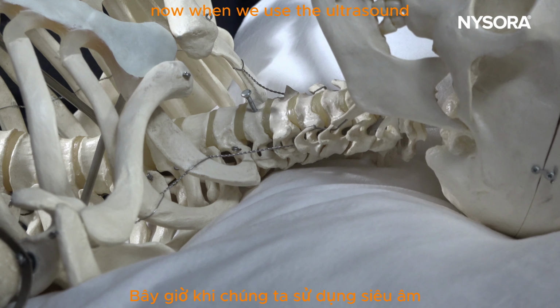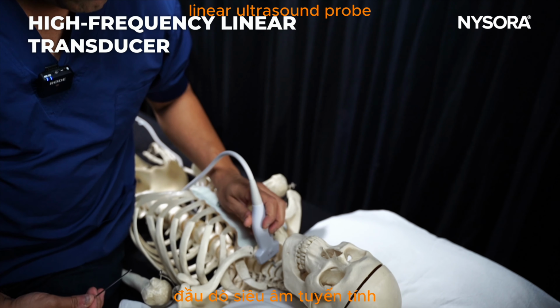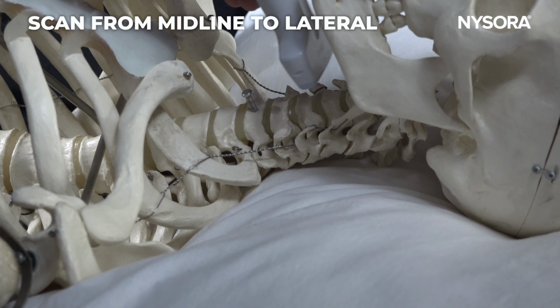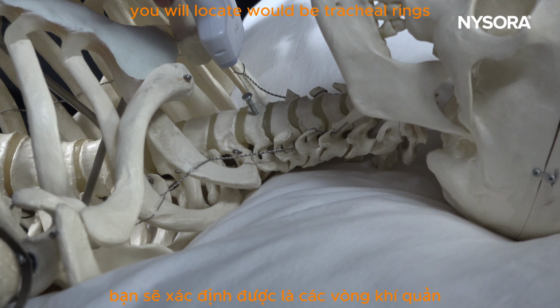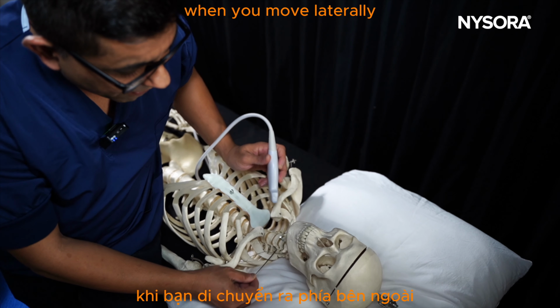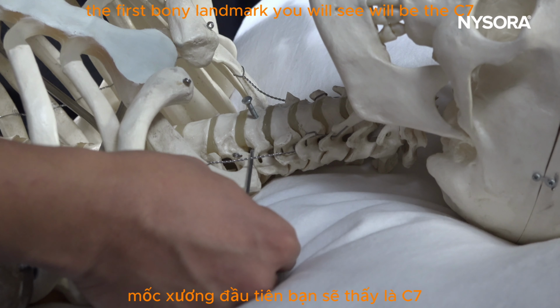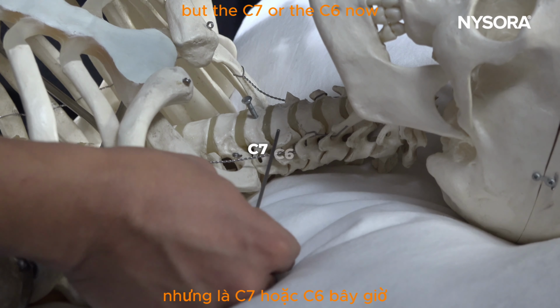Now, when we use the ultrasound, I always recommend using the high-frequency linear ultrasound probe and scan from the midline to the lateral side. Midline structures you will locate would be tracheal rings, and we will also visualize the thyroid gland, and then you will move laterally. When you move laterally, the first bony landmark you will see will be the C7, depending on what level you are, but the C7 or the C6.